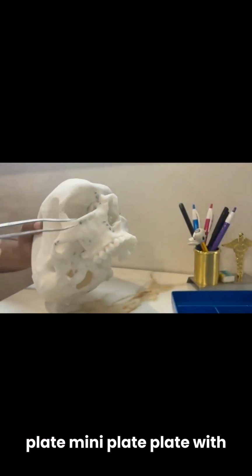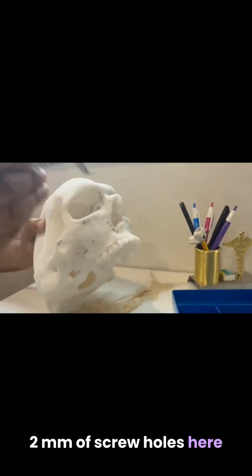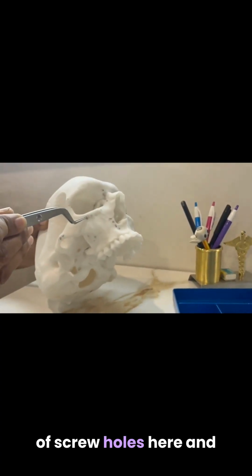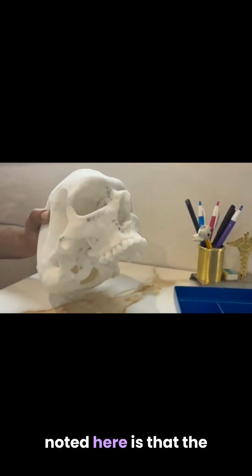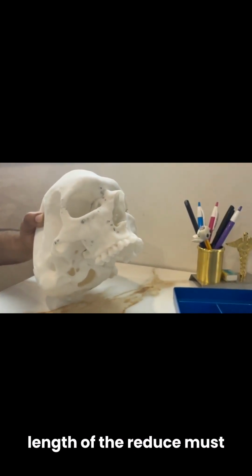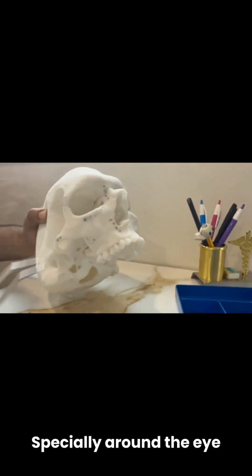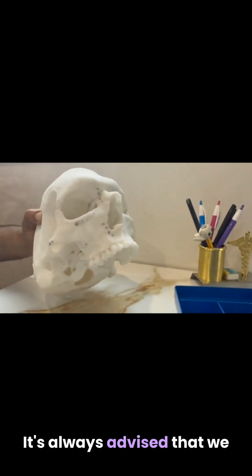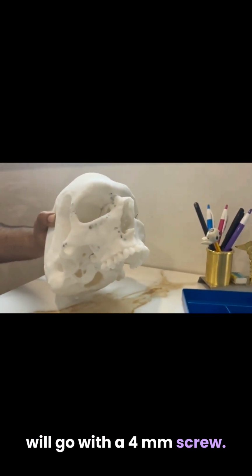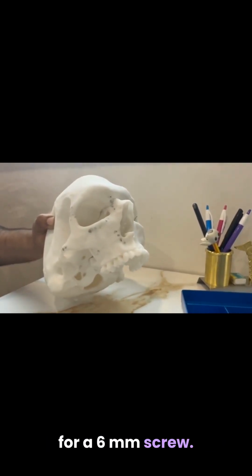So we are going to plate a mini plate with 2 mm screw holes here, 1 mini plate with 2 mm screw holes here, and 1 mini plate with 1.5 mm screw holes. The point to be noted here is that the length of the screws must be 4 mm or maximum 6 mm, not more than that. Especially around the eye or towards the nasal bone, it's always advised that we go with a 4 mm screw, and if possible, if anatomy allows, then only go for a 6 mm screw.